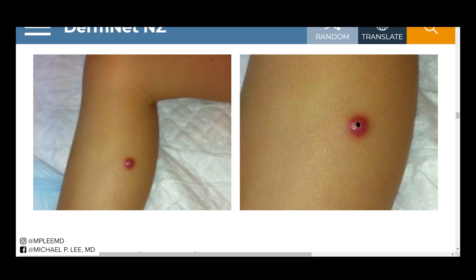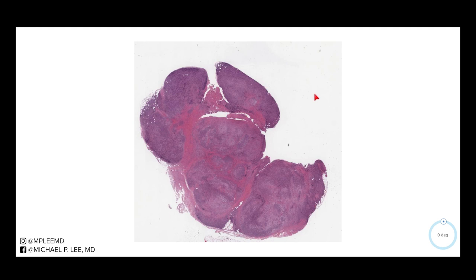Microscopically, you can see that most of these tumors are within the subcutis, but occasionally you can have primary dermal lesions. From a low-power perspective, the main thing I like to use to make the diagnosis is this kind of bluish color and a sort of pale or pink color in between. All these areas here are fibrotic zones. So you have a multinodular pattern microscopically, with blue and then kind of pale pink in color.